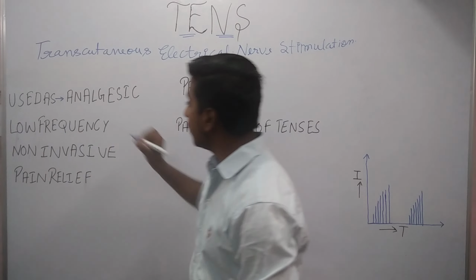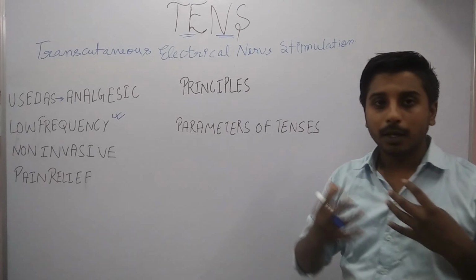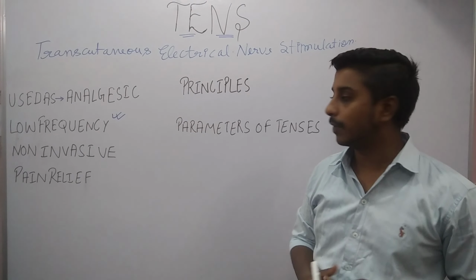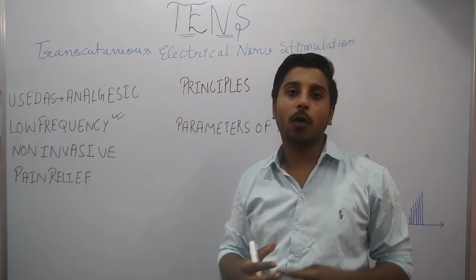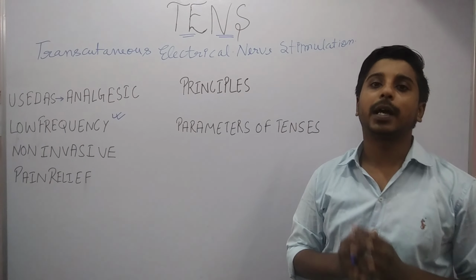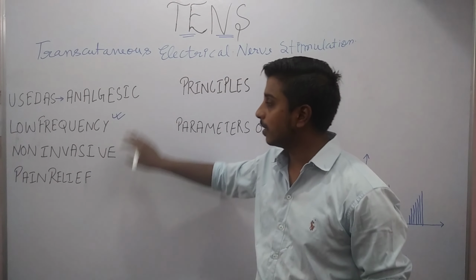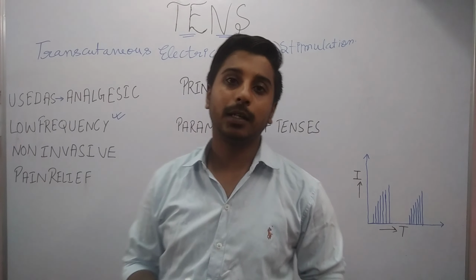Another point is that it is a low frequency current modality. It has a very low frequency current, which we will learn about in our future videos. Then, it is non-invasive. Non-invasive means there are no needle electrodes or indwelling electrodes. We simply use surface electrodes which apply the current through the transcutaneous path, and it is used for pain relief, same as the first point. So these are the main terms.